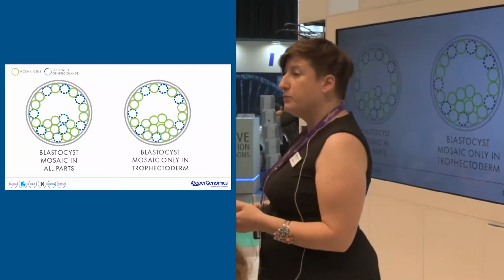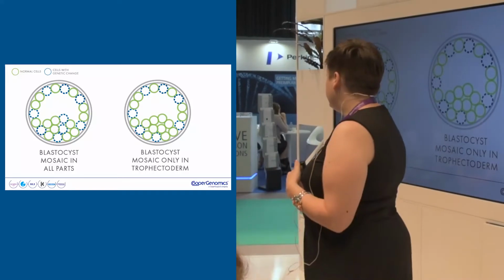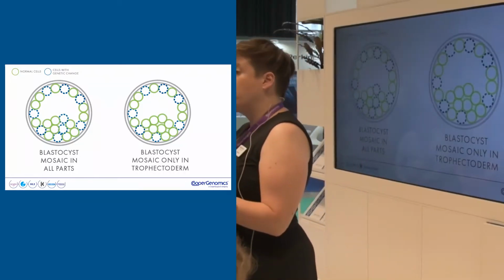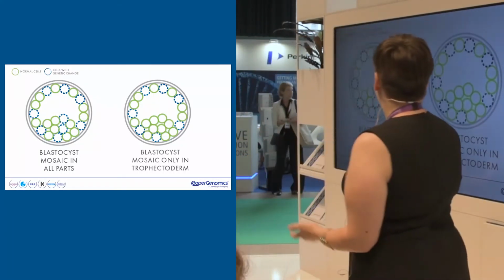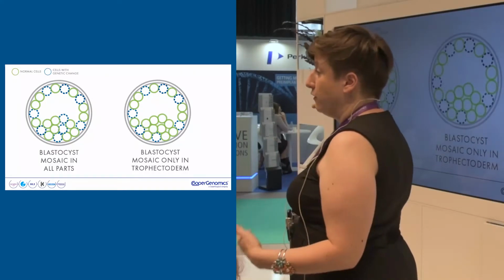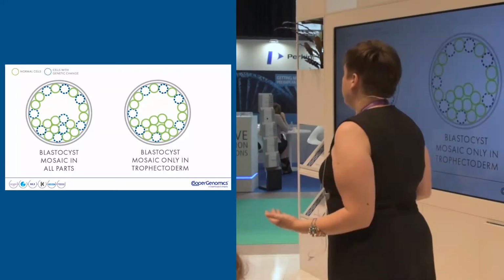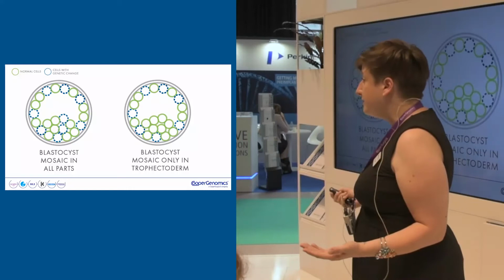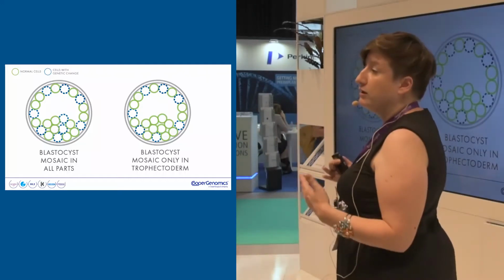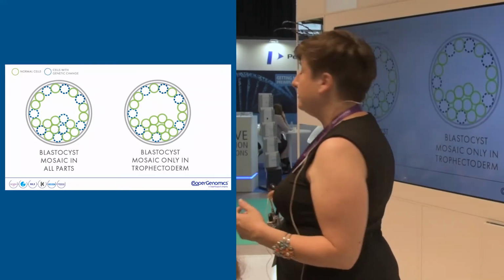We can tell you if a sample is euploid, we can tell you if it's aneuploid, we can tell you if it's mosaic. We can tell you that low-level mosaicism correlates well with good outcomes. We can tell you that high-level mosaicism correlates poorly with outcome, but we cannot give you 100% of an answer as to whether that is representative of the inner cell mass or not. But again, it comes to how important is that, because you need a functional placenta for a successful pregnancy as well. But as I say, it does seem that low-level mosaicism, regardless of the chromosome, correlates positively with clinical pregnancy and successful outcome.